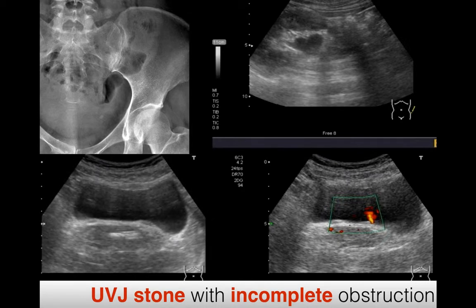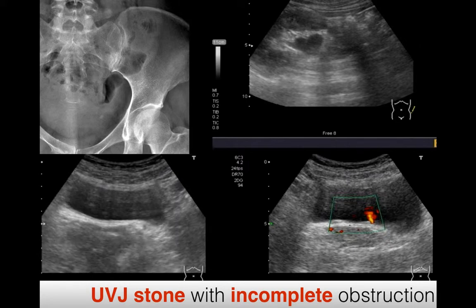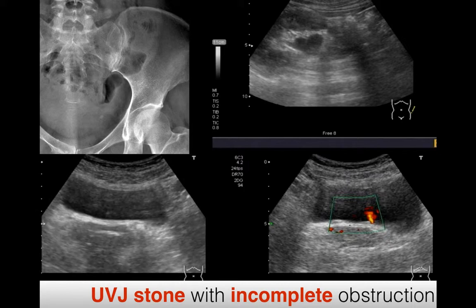You can see here, this is the ureter from the medial posterior part going into the bladder. Here we can see a hyperechoic stone, because I have a good window. If urine is expelled, so the bladder is collapsed, it is difficult to scan that.